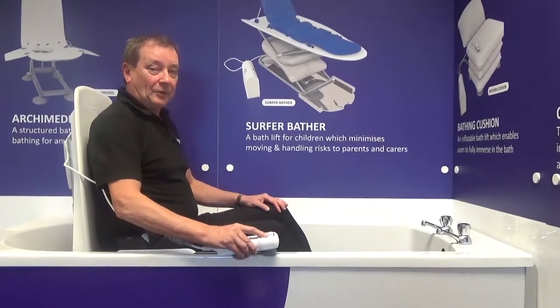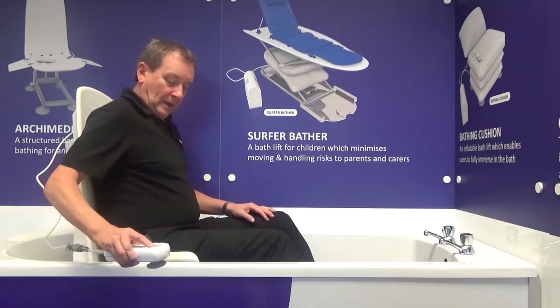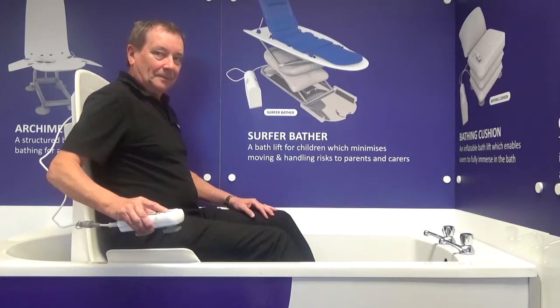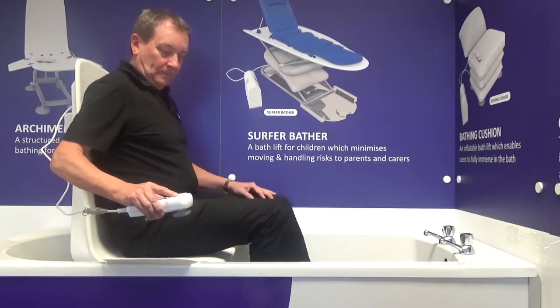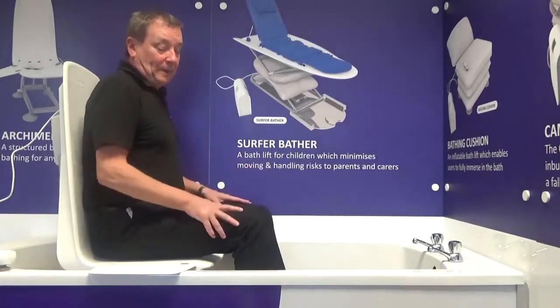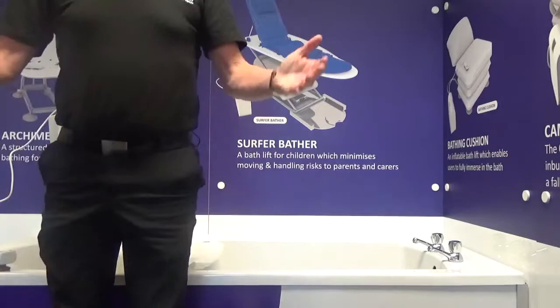Again, if I need to stop, I can just take my finger off the button and the bath lift will stop anywhere. I want to keep rising until the flaps are level with the top of the bath. And now it's safe for me to transfer off the bath lift. This is done quite simply by lifting my legs out of the water, turning round, slide across the flap, and I'm off the bath lift.